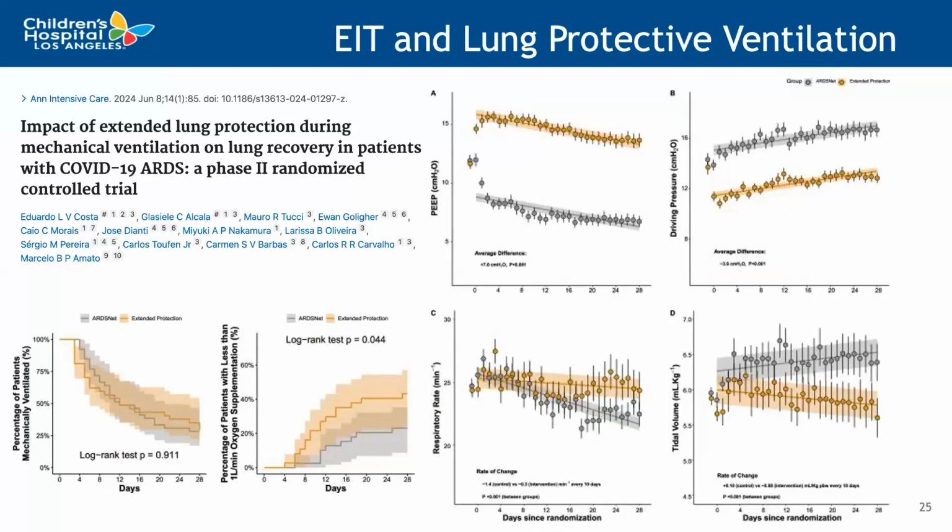And what they found is that the patients in the EIT guided management arm had generally lower driving pressure, generally higher PEEP, and lower tidal volumes. And so generally were managed with a more lung protective ventilation strategy.